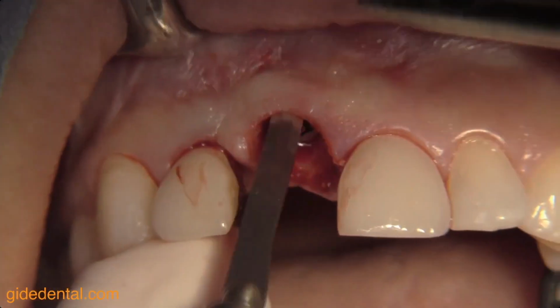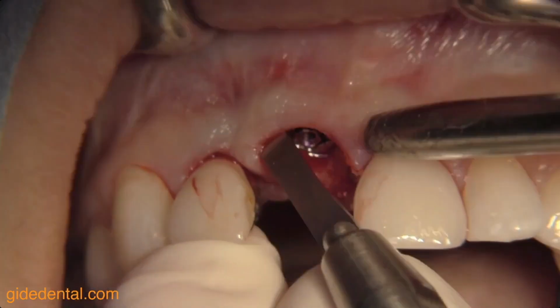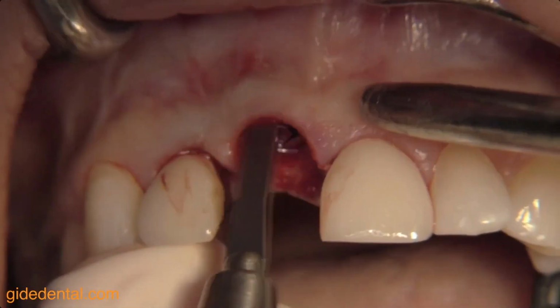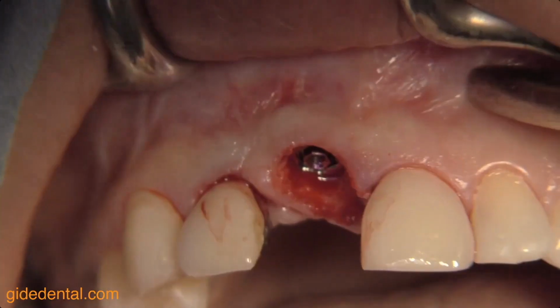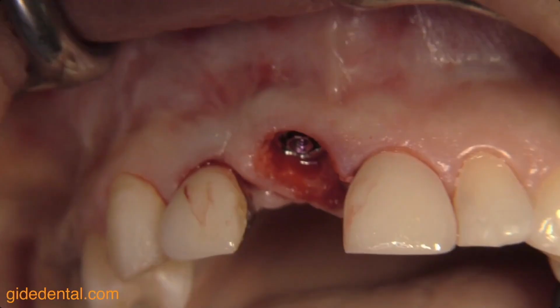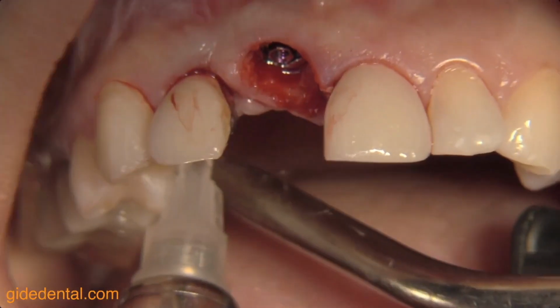And you can do a lot of loosening of the tissue with a blunt instrument or with a sharp instrument. If you work with a sharp instrument like here, of course be very careful because you have to really pay a lot of attention to detail. I have to be very meticulous so you don't do any kind of miscutting in that area.